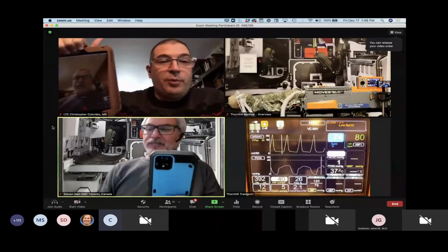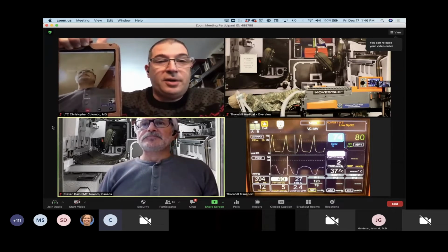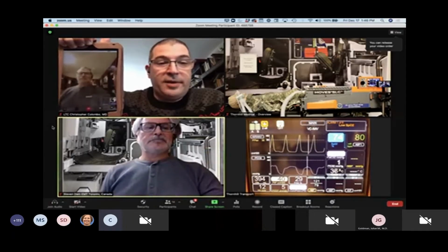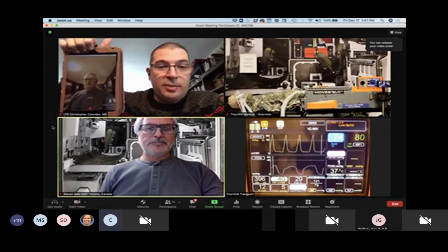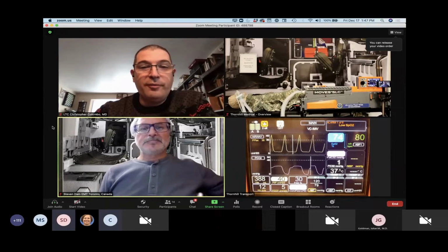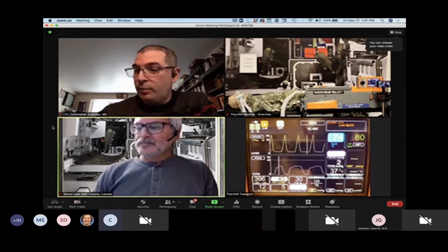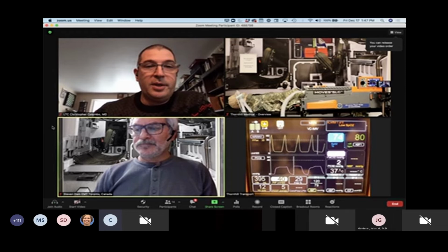On the Omnicare app, we can communicate via video teleconference or audio if we have reduced bandwidth. We can also send each other text messages, clinical practice guidelines via PDF documents, take photos, videos, and send those back and forth in order to provide two-way communication for synchronous or asynchronous telecritical care. A feature of the app, not a bug, that prevents us from sharing that video for this demo is that it is HIPAA encrypted and cyber secure compliant. So we will be sharing our audio and video through Teams and Zoom as we have been, but we would normally be communicating through the app.